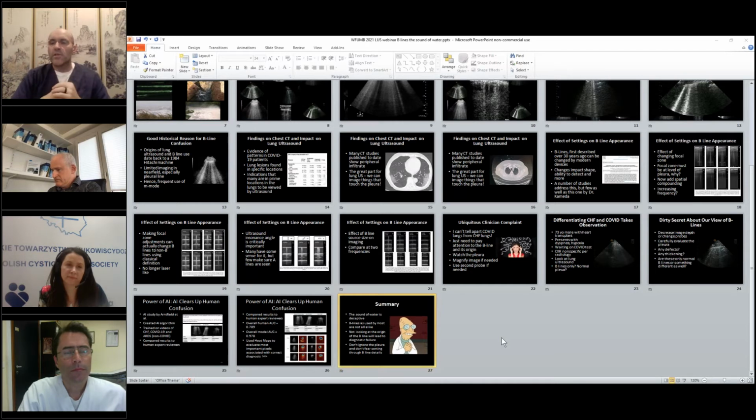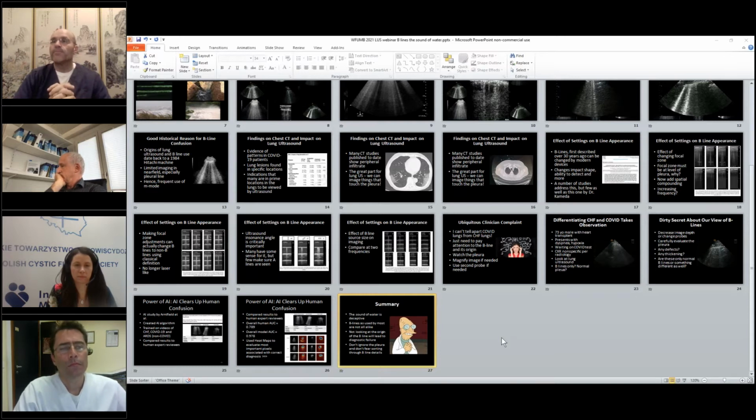And if you have lung ultrasound findings that have not changed, let's say they're moderate in an admitted patient, but yet oxygen requirements are going up, saturation is going down, remember that these are patients that are at much greater risk for thromboembolic events, and that may push the clinician to consider pulmonary embolism. So there are, I think, many reasons to continue using lung ultrasound throughout a patient's stay to manage them.